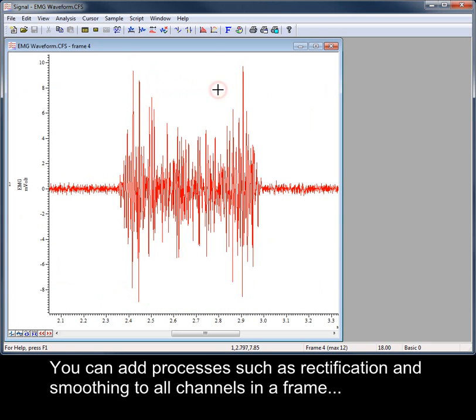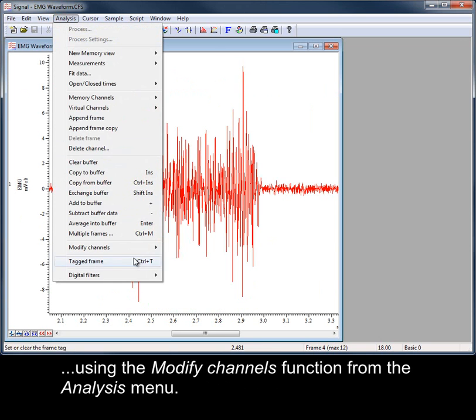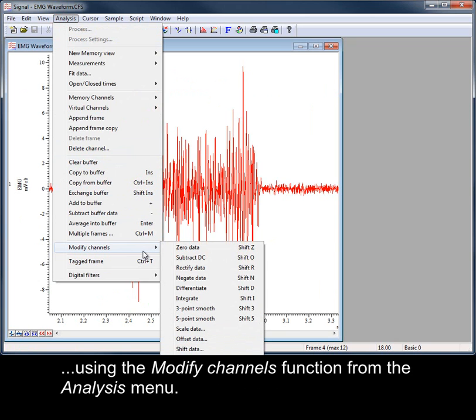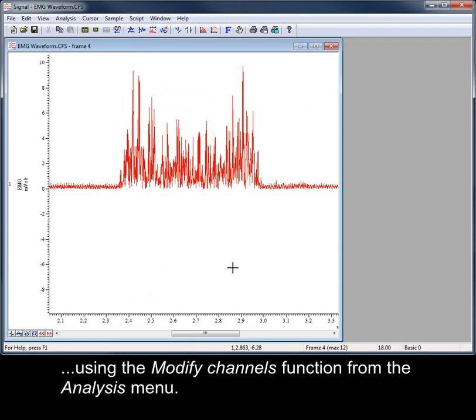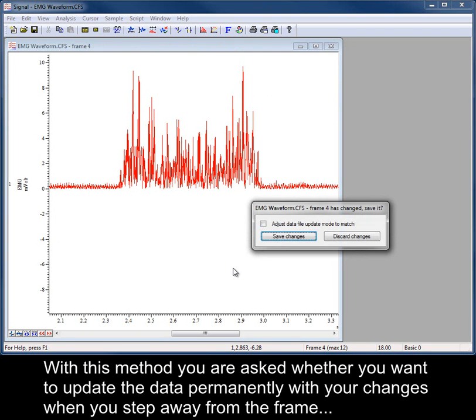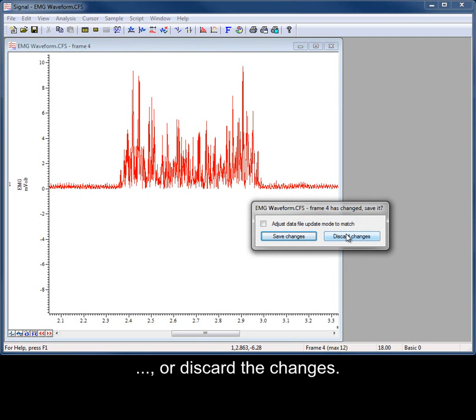You can add processes such as rectification and smoothing to all channels in a frame using the Modify Channels function from the Analysis menu. With this method, you are asked whether you want to update the data permanently with your changes when you step away from the frame, or discard the changes.